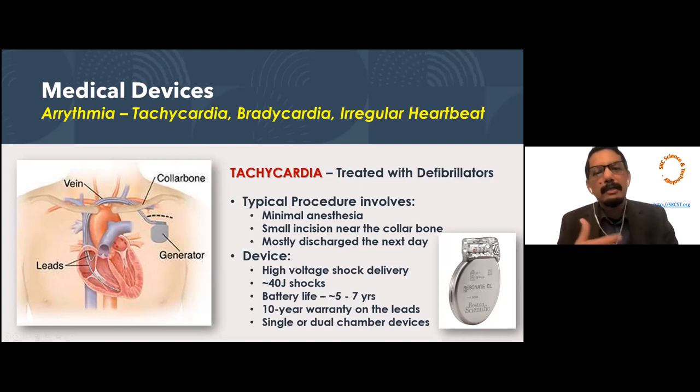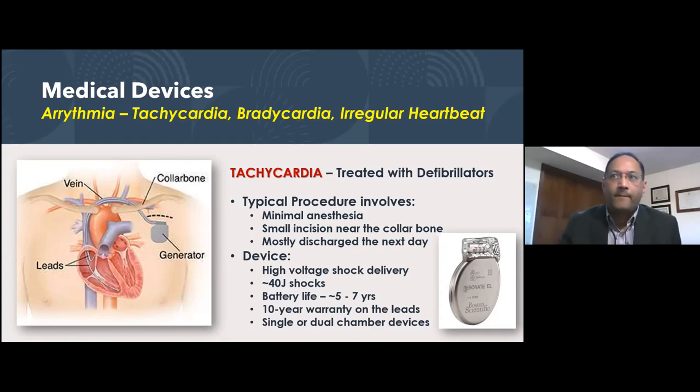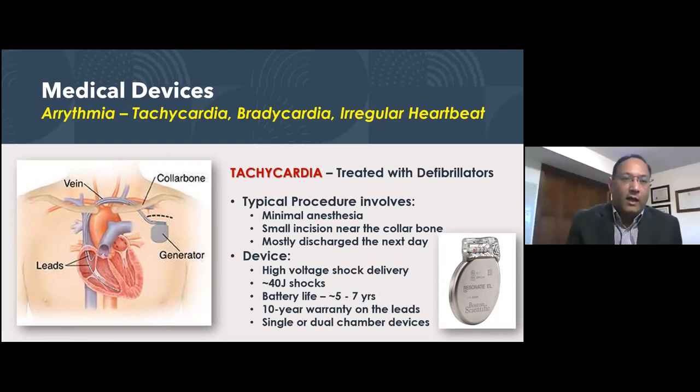And if you are getting this kind of information through wireless, then whoever the doctor is monitoring it will be able to know which one is working there. And yes, you can estimate the lifetime of the battery based on that, I suspect. Absolutely. So that's a very important part, where the battery is at, and to call the patient back in order to do a replacement.